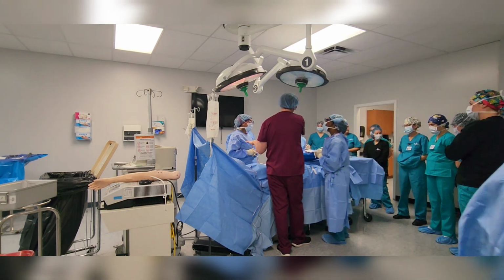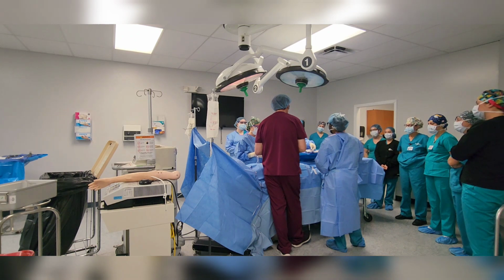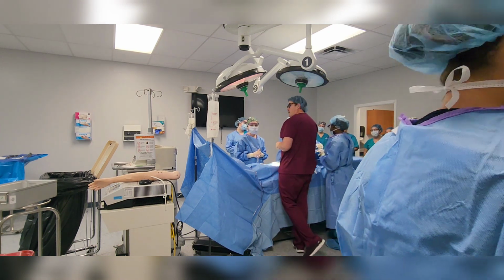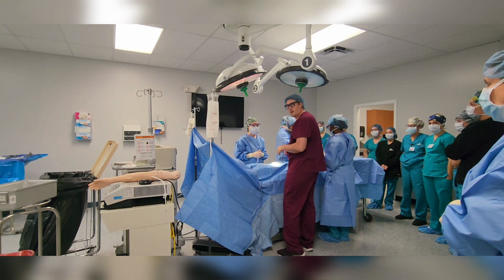Let's switch a little bit. You come up here, Brooke, and then eventually we'll get you on that side too, okay? And I want everyone to at least try to go through that a little bit. We'll do it really quickly here, but keep this as organized. For just this, I like to get those blades in the back so I don't hurt myself.